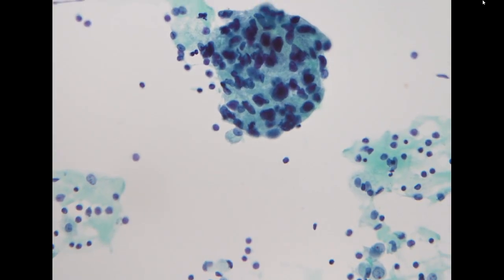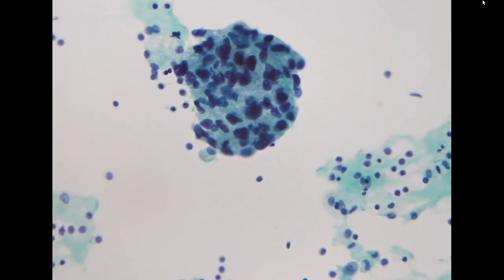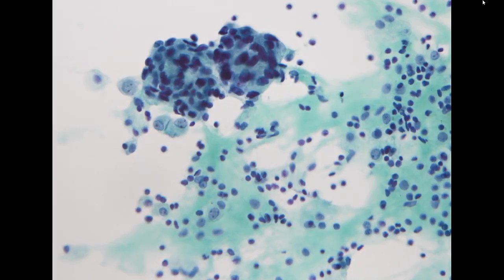But the cells still have quite a moderate amount of cytoplasm, and the arrangement of these clusters looks like glandular differentiation. So it is a little bit atypical for the lung adenocarcinoma that we just saw.